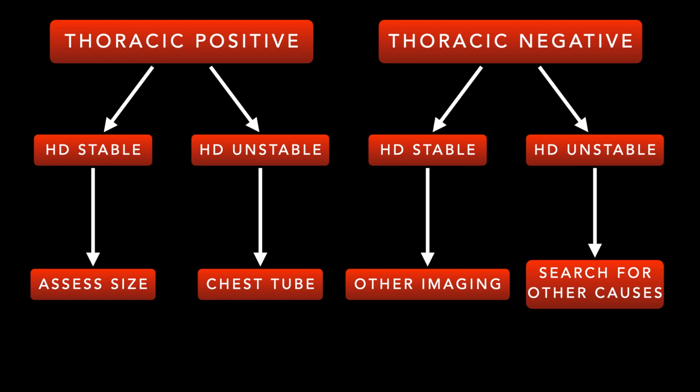Do they have a head bleed? Do they have blood in their thigh? Do they have a bunch of blood that's leaking on the floor? What are the other causes for potential hemodynamic instability in this patient in the trauma bay? So that's kind of the general idea of the FAST exam, right?